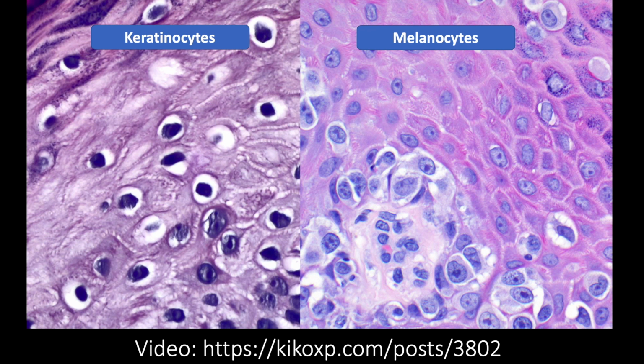First of all, recognizing what melanocytes are and telling them apart from keratinocytes. Sounds easy, but a lot of times people struggle with this. Even I see practicing pathologists sometimes struggle to tell these apart, but there's a simple trick, okay? It doesn't work all the time, but it works much of the time. Both keratinocytes and melanocytes tend to make vacuolation artifacts when we process them in the laboratory, but the type of vacuole they make is different.